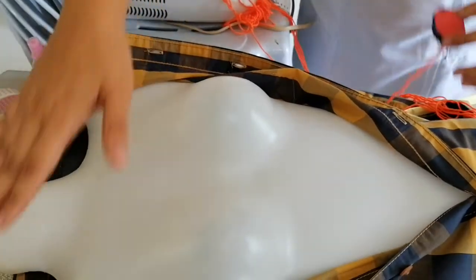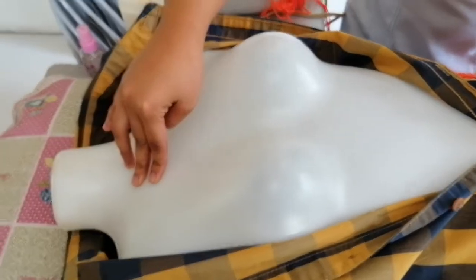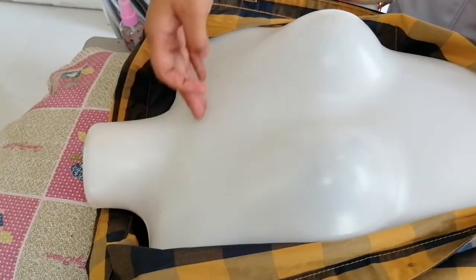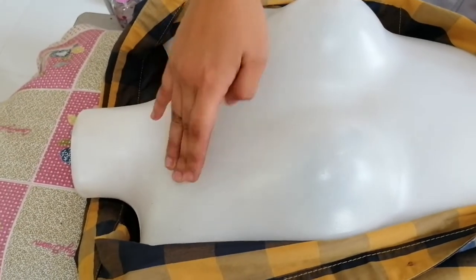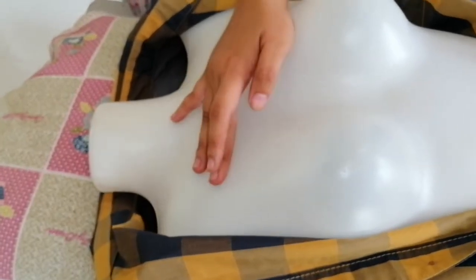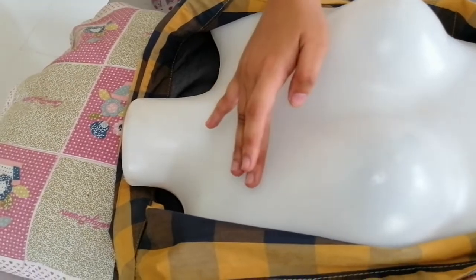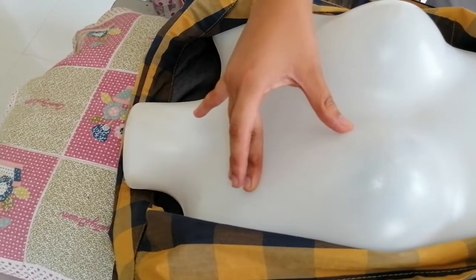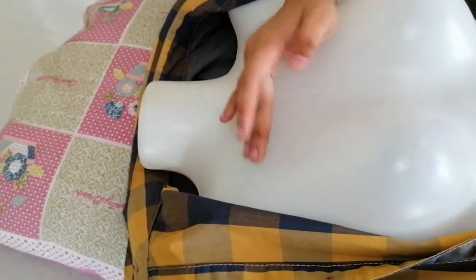So this is the right part of the chest. We are going to locate this. For example, we're going to draw an imaginary line here to represent the sternum, and then we're going to begin counting the spaces starting here in the sternum until the fourth space, fourth intercostal space, right sternal upper border of the sternum. Then let's palpate.